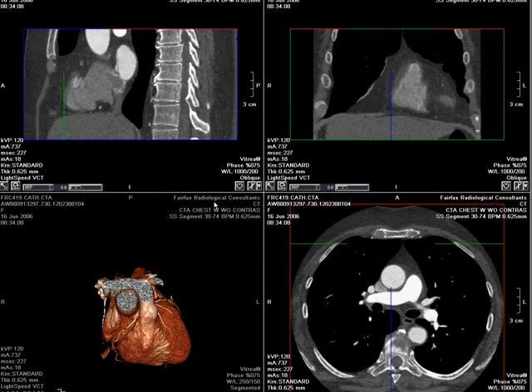A 57-year-old female with a history of atypical chest pain and an equivocally positive stress test along the inferior wall was referred for a coronary CTA. Given her history, we are going to focus our attention on the right coronary artery.